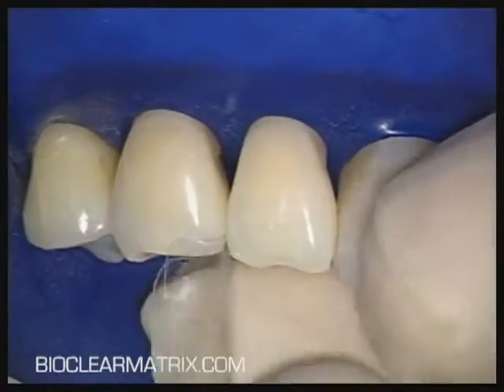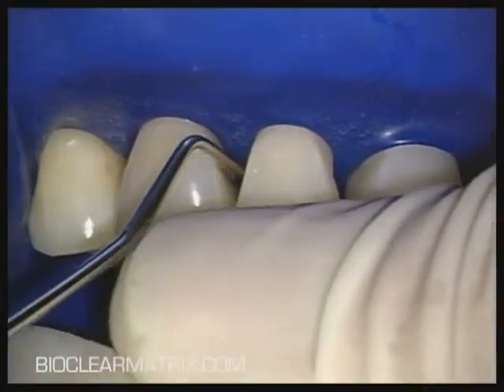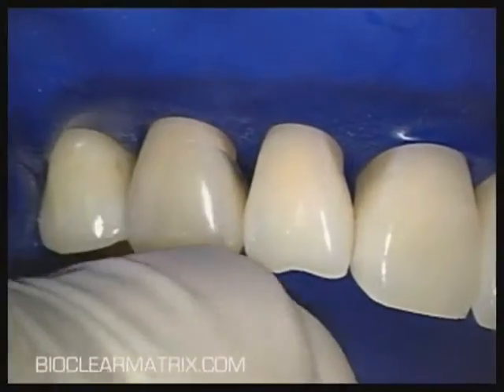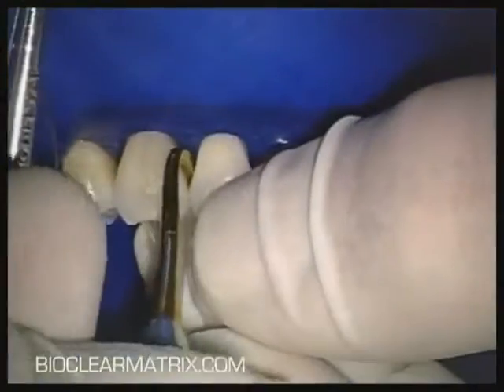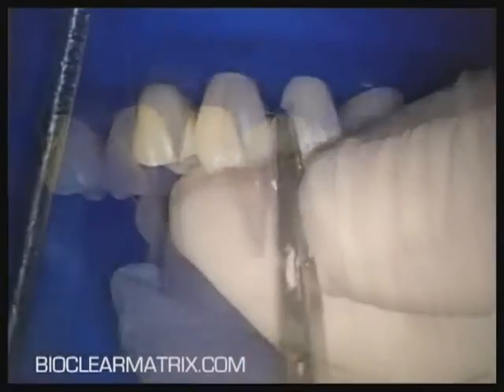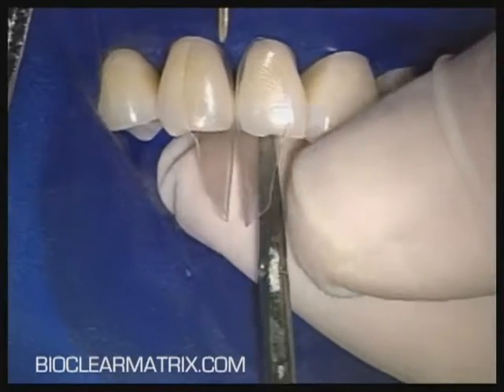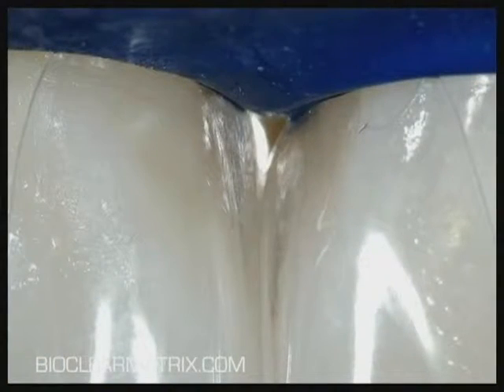Because the clear mylar is more delicate than a metal strip, you will need to gently separate the teeth to be able to place the matrix. In Don's case, there was no tooth size discrepancy. Therefore, I chose to close each black triangle with two matrices.